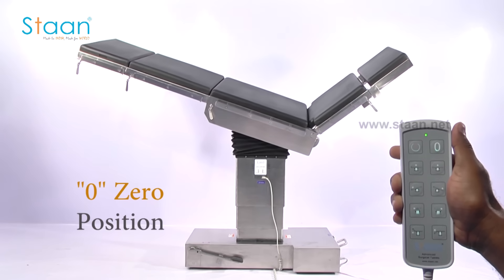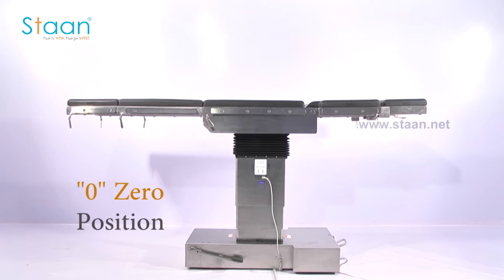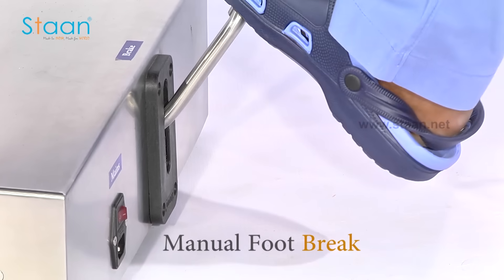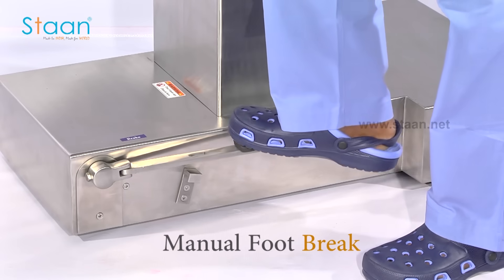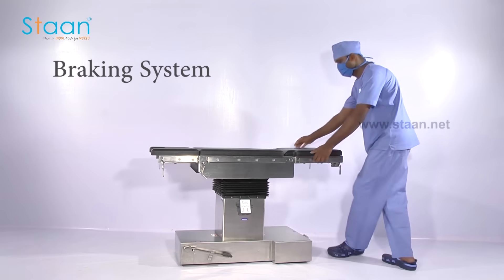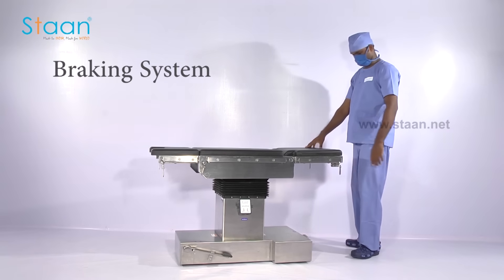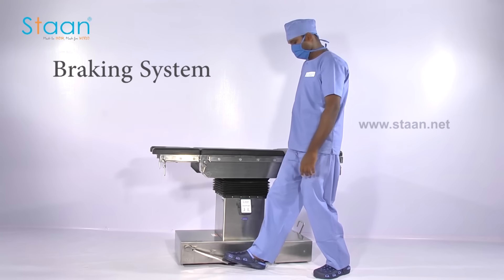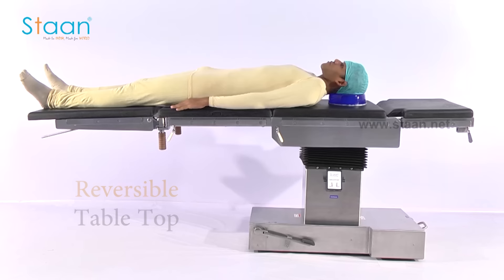Zero position memory is present to bring the table top back to a flat position. Smooth single foot lever operation is available for braking and unbraking. The table top is reversible.